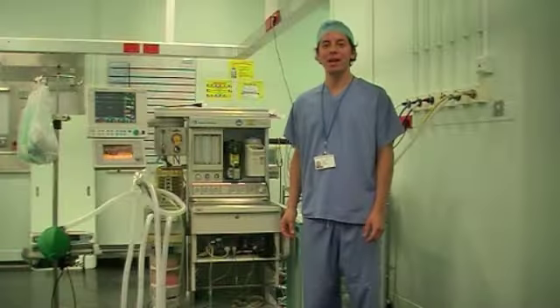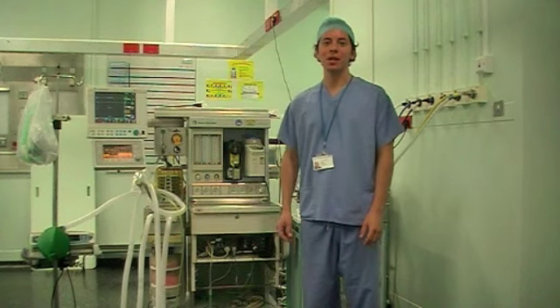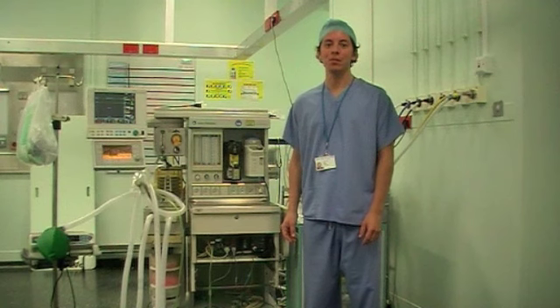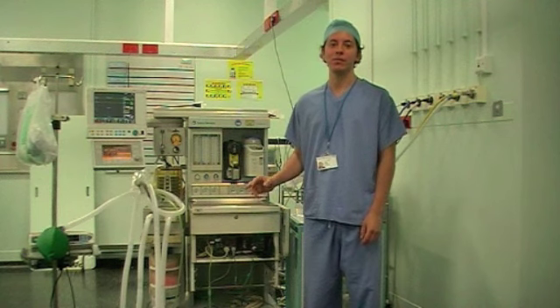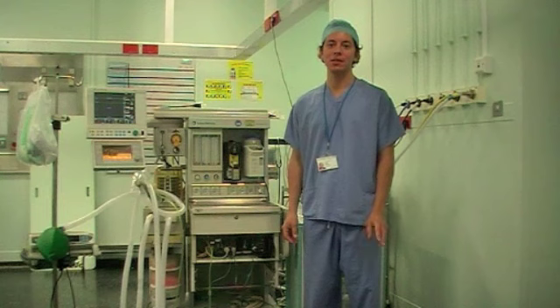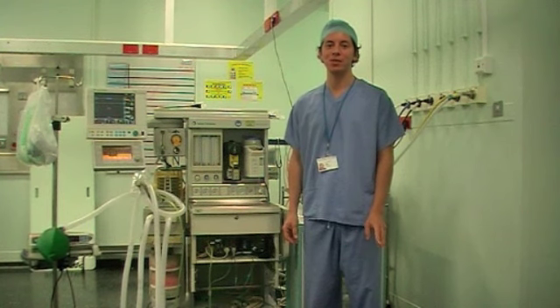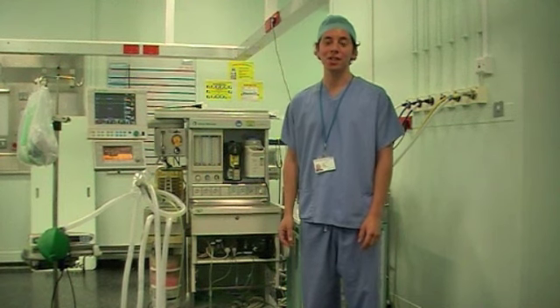Gas supply and suction. The gas supply to your anaesthetic machine will come in two forms: the main pipeline gas supply from the wall, and gas supply cylinders on the back of your anaesthetic machine. There are three medical gases running to the anaesthetic machine: oxygen, nitrous oxide, and air.